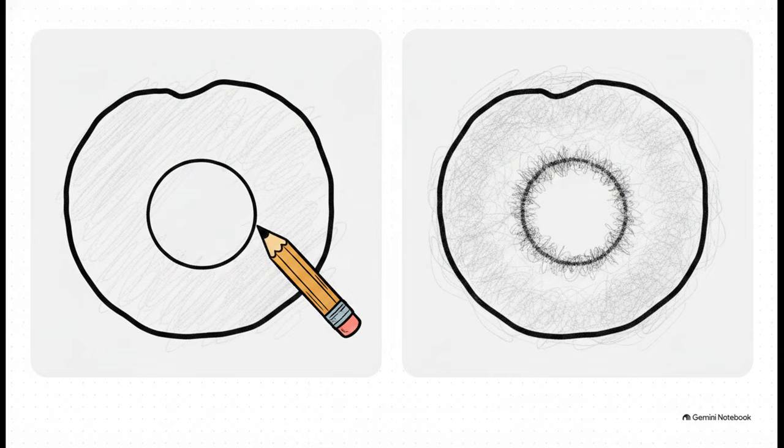Before you look at the matrix, before you even check for a periosteal reaction, look at the margin, the zone of transition. This is the absolute fastest read on any lytic lesion. A sharp, narrow margin where you could practically draw a definite line with a pencil strongly suggests a benign, slow-growing process. But a wide, fuzzy zone of transition where you can't really tell exactly where the lesion ends and normal bone begins, that just screams aggressive and fast-moving. It's the rule of contrast, and honestly, it's going to be your best friend.